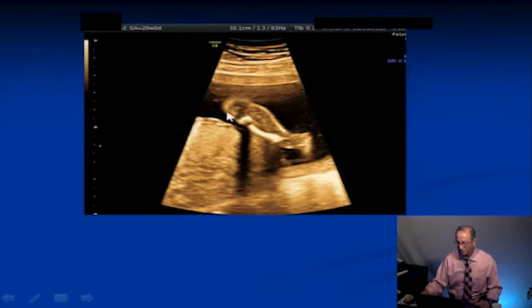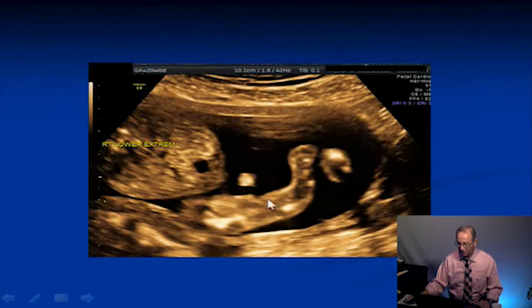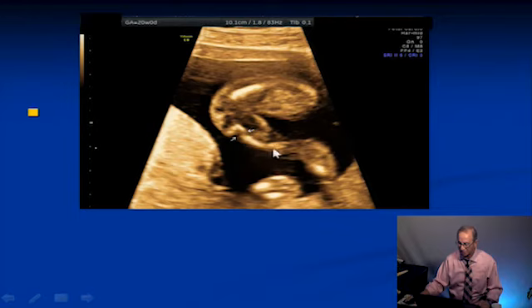This is the fetal arm we're looking at here. You see the arm here, but the bone is short and bowed. That's abnormal. Here's the leg. Here you see the bones of the leg, and the baby has club feet, and the bones are abnormal. Here's a fracture. You can see the femur there, bowed and fractured. And that's 20 weeks, okay? Guess what this baby had? Just a guess.